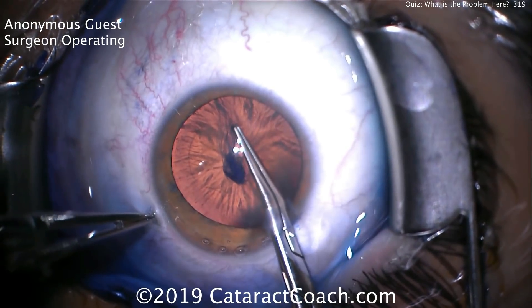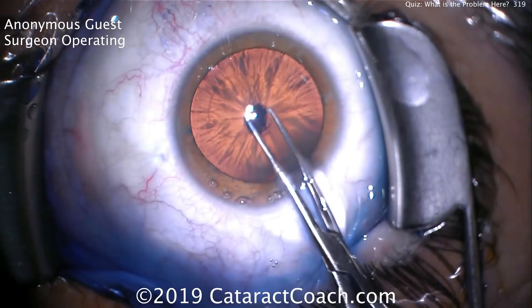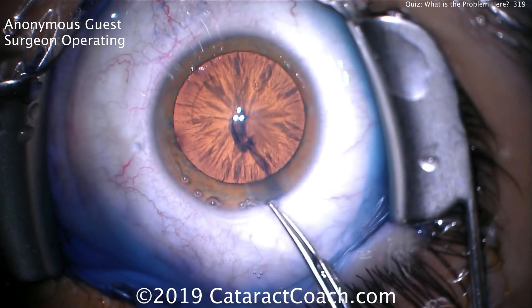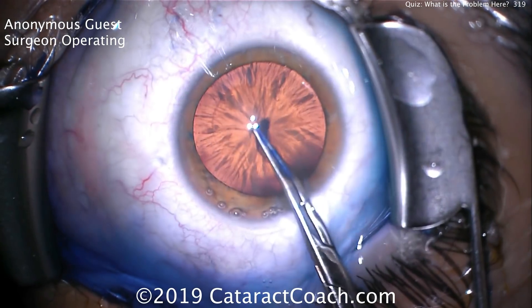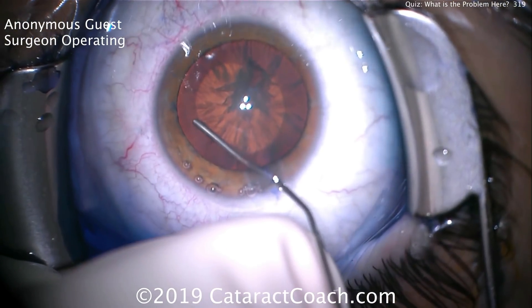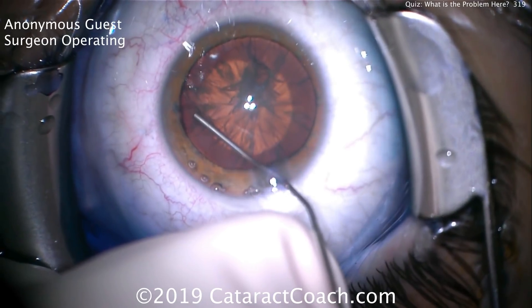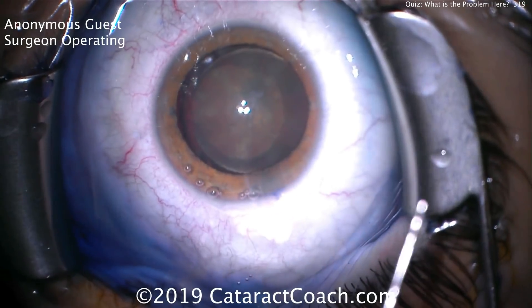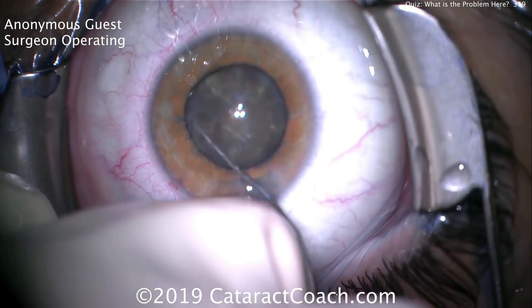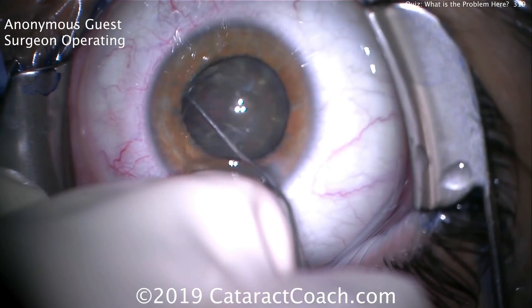It's an otherwise routine case — a cortical cataract. A nice capsulorhexis has been performed, very well centered and round. They're taking out that anterior lens capsule, so this is a good rhexis. A little hydrodissection is being performed now. This is a relatively soft lens, so the surgeon is going to get the lens prolapsed out of the capsule bag with a little viscodissection.